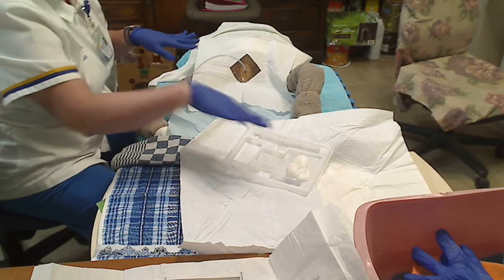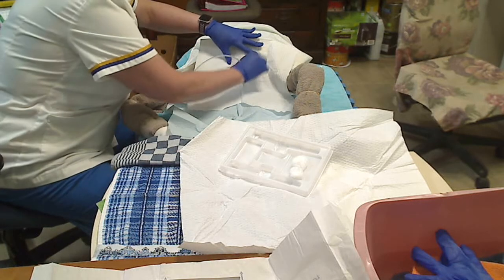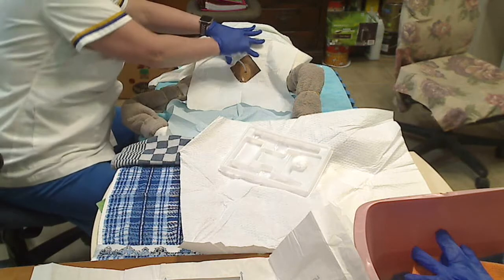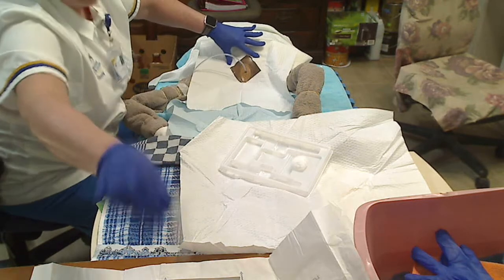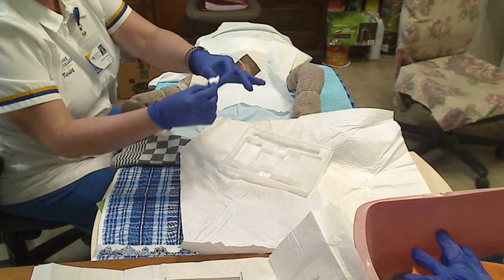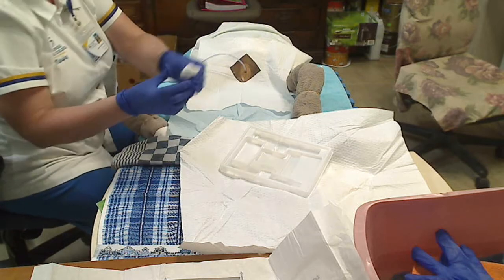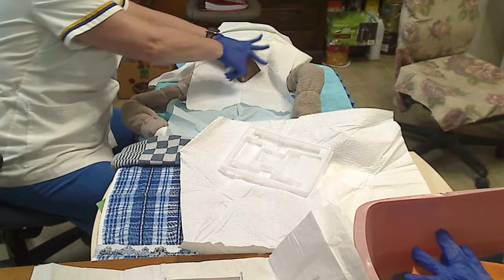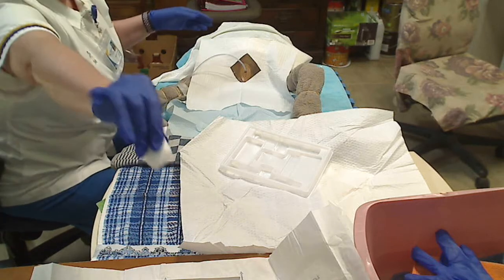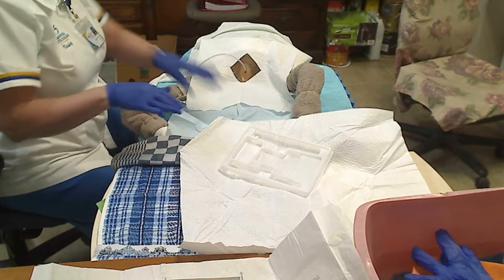I'm going to go ahead with my last little bits of cotton ball and do a last little bit of peri-care. So once down, once down. I'm going to rip this one in half. I'm going to use half of it to come down the center, and the other half to clean the outside of the tube where there might be some sticky left on it. Now my sterile procedure is done.